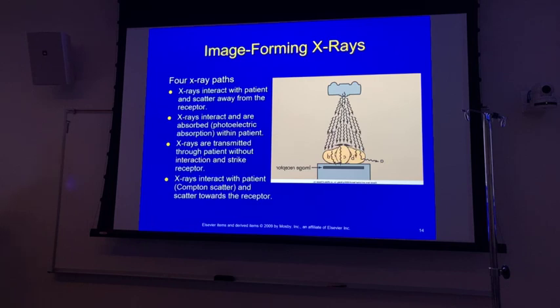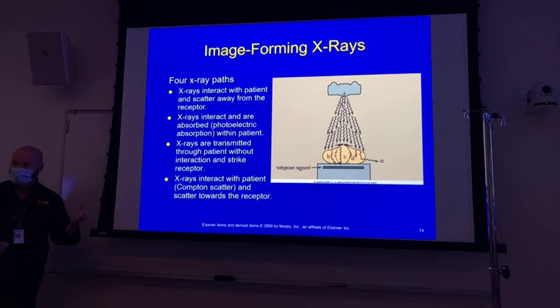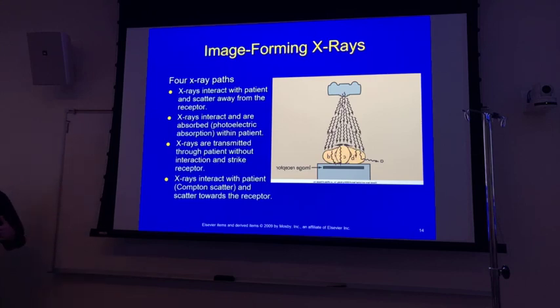Also, there was a hallway that went from one of the rooms to the other, in between. A little bathroom back there. So we took a film, we shot just directly into the wall with a lateral L-spine technique, took a film and just kind of held it out from in between these rooms, right? Just to see how much scatter radiation we got from behind the control panel, and it was significant. Again, you could see the bones in your finger, and that was 10 feet away, 90 degrees.